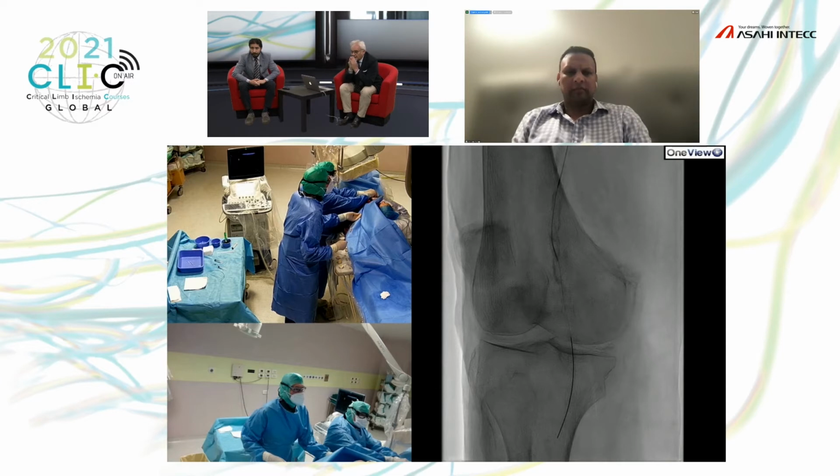So if I can say, it's different from, for example, the Astato 20, to speak about a wire of ASAHI.